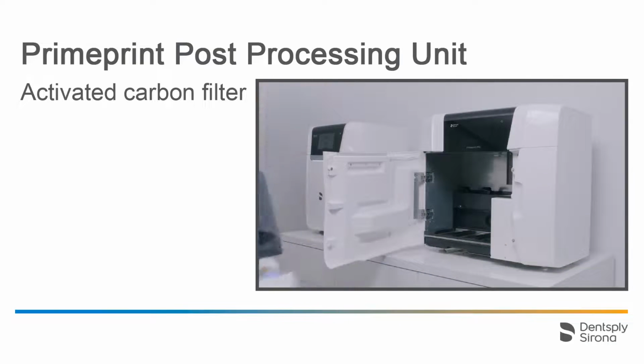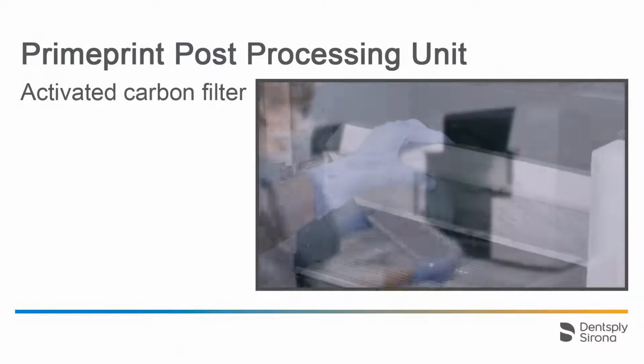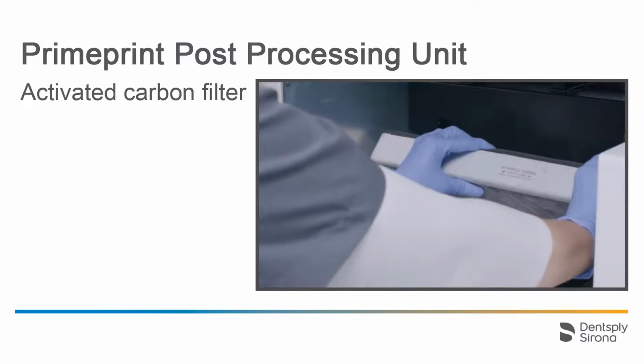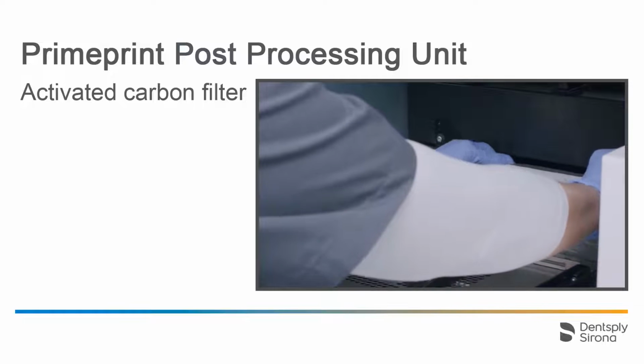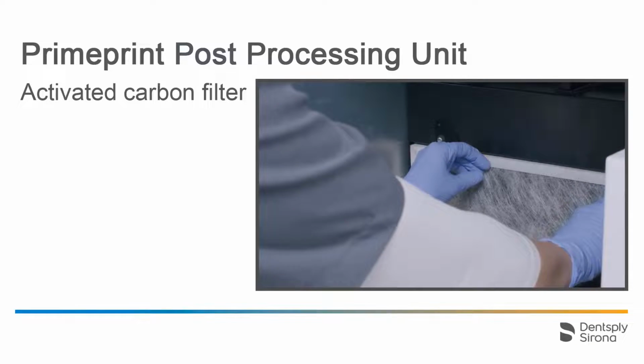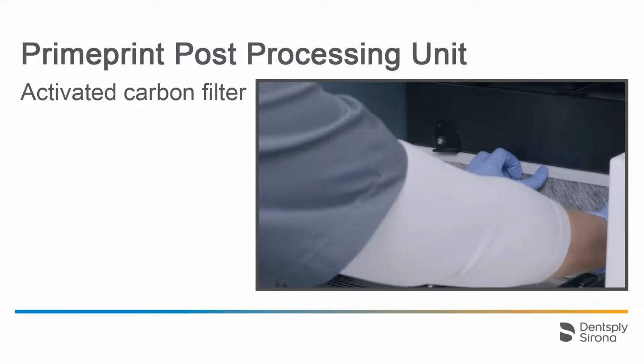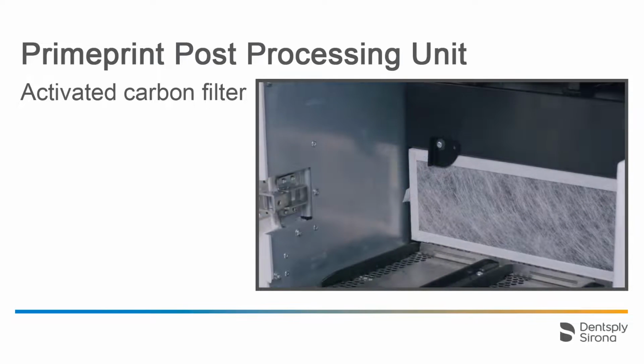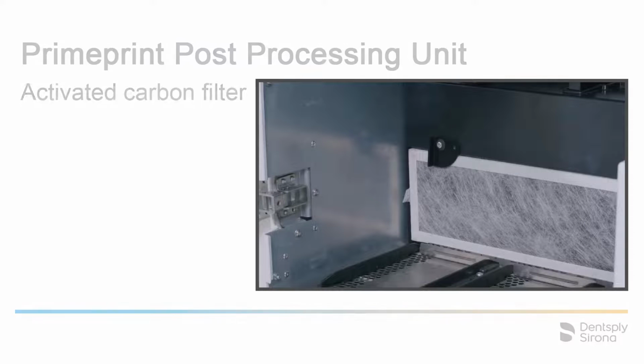Generally, the used filter can be disposed of with the regular household waste. Observing the direction of the arrow on the filter, we put the new filter back in place. First, we place the filter behind the metal sheet, then push it completely into place and turn the two locks by 90 degrees clockwise to fasten it.